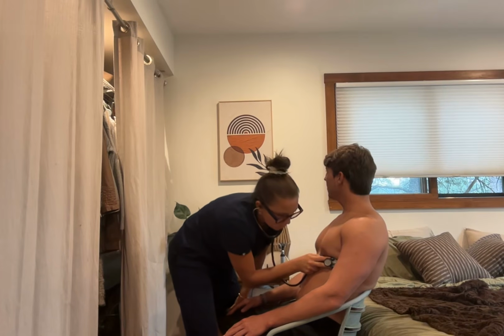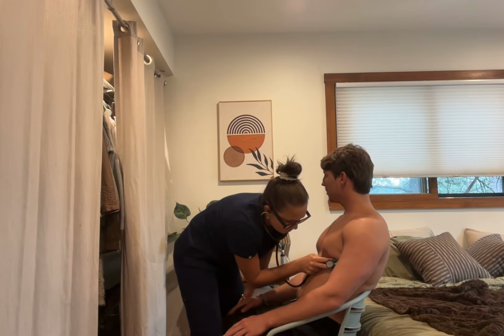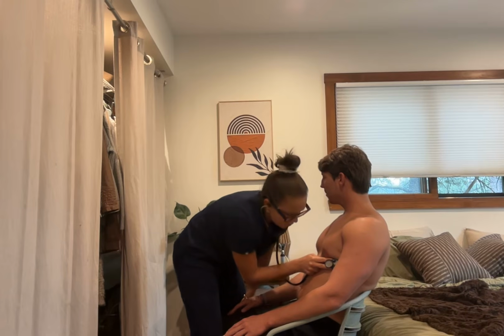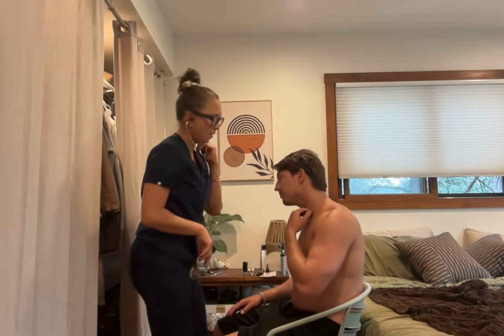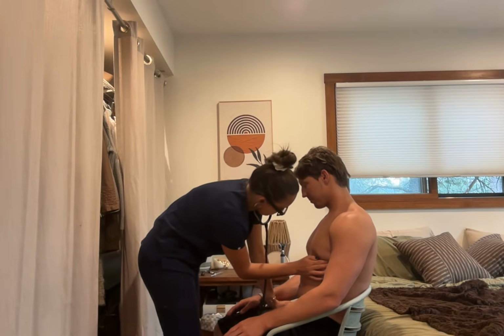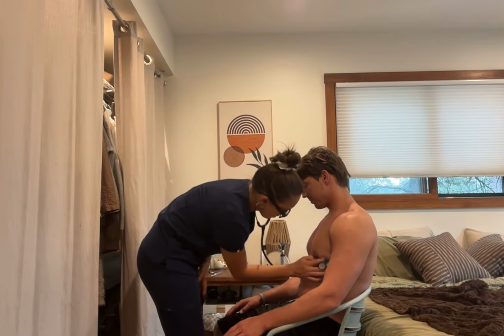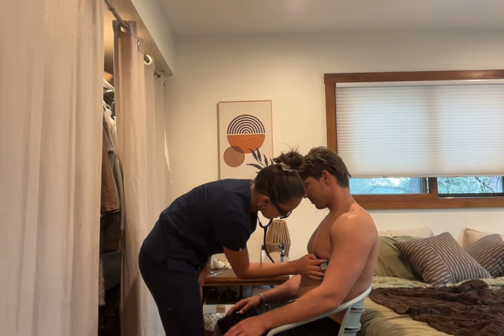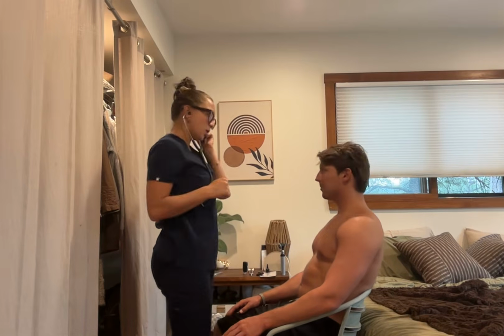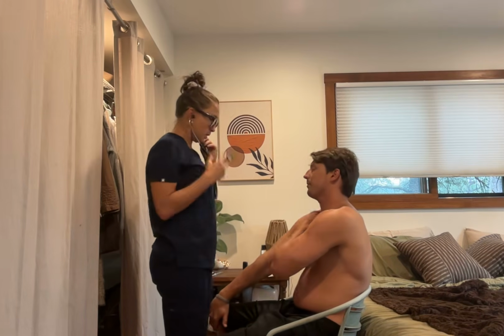And to the mitral valve with just the diaphragm. Good. And just palpating for the PMI here. Good. Now, auscultating the PMI. No murmurs, no clicks. S1 and S2 heard in all 4 quadrants.